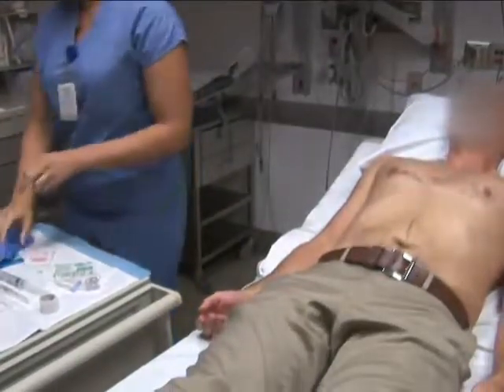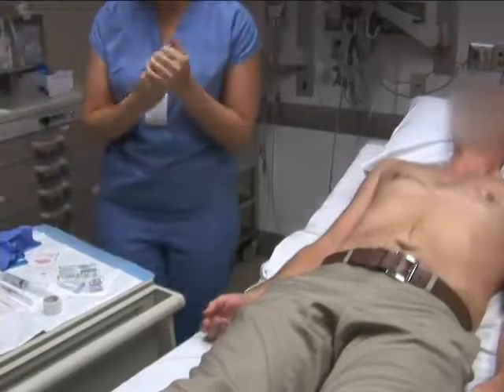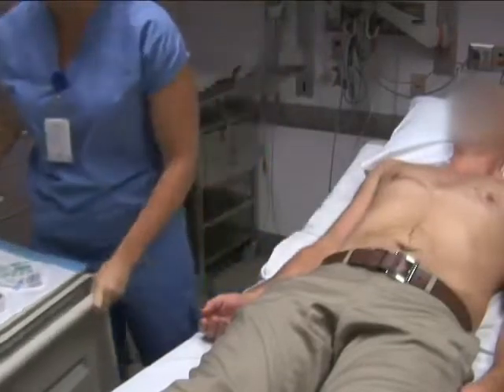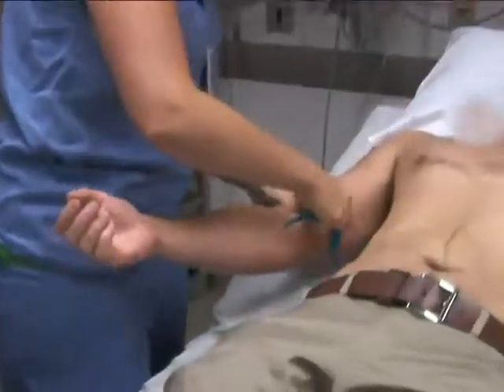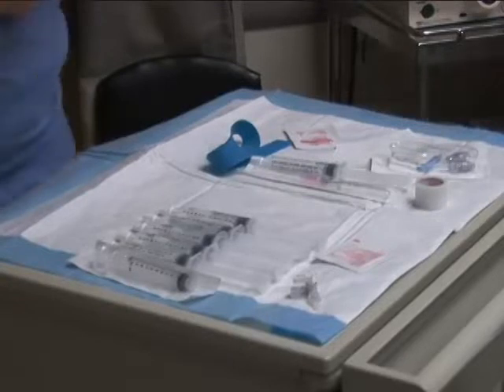Echocardiographic contrast is done as part of a complete echocardiographic study. Agitated saline contrast is used to opacify the right heart and diagnose a right-to-left intracardiac shunt through an atrial septal defect or patent foramen ovale. First, we will demonstrate a saline contrast study.